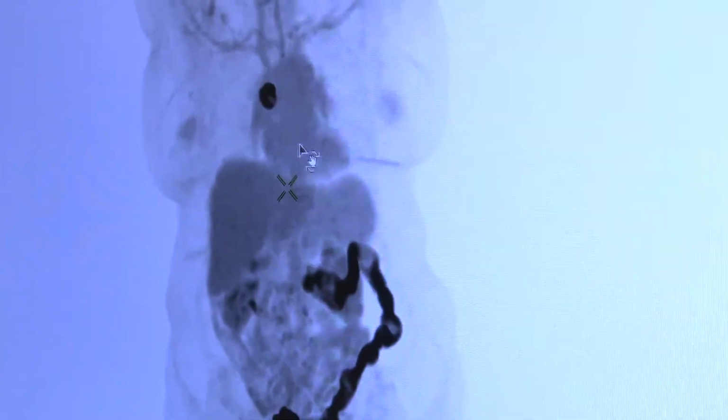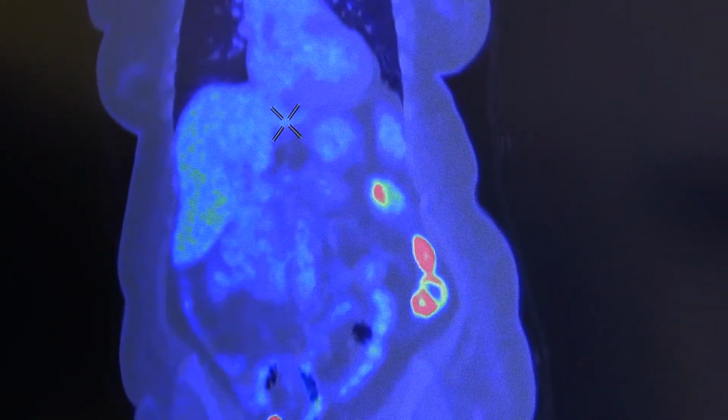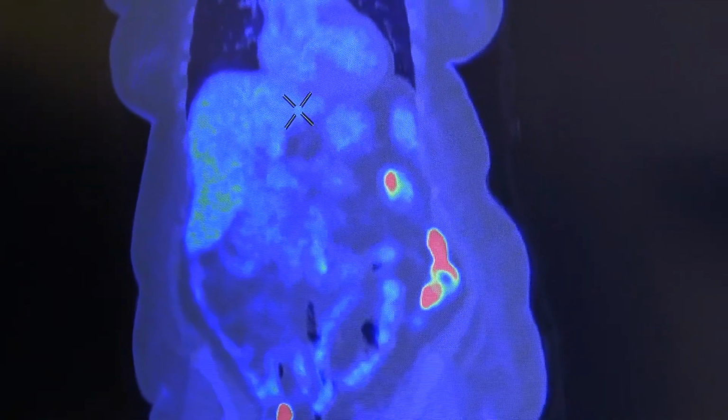There's a nuclear medicine physician in the other room, and they're going to be looking at those scans, making sure that they're okay, that we didn't miss anything, that there weren't any technical artifacts. And we'll usually try and do same-day reporting. So patient comes in, has their scan, and there's a report finished and finalized on the system by the time they're at home having dinner.